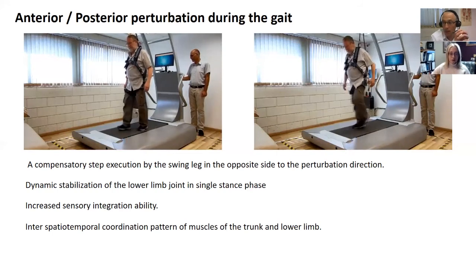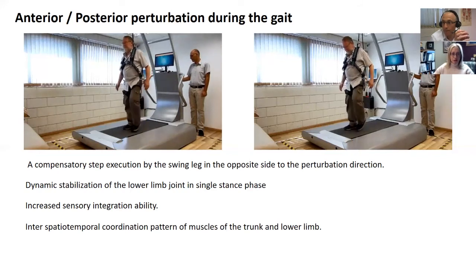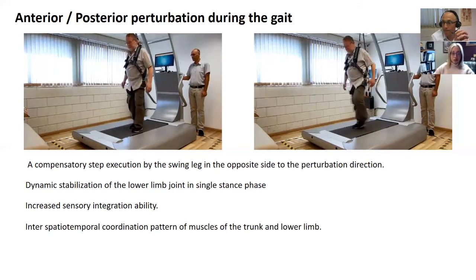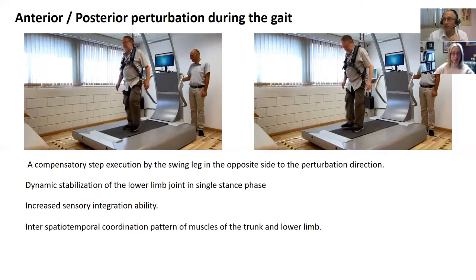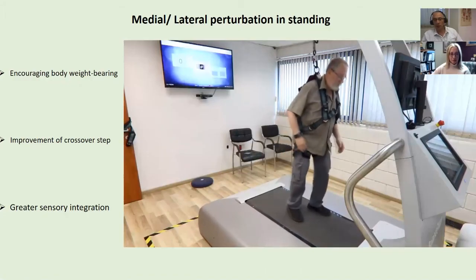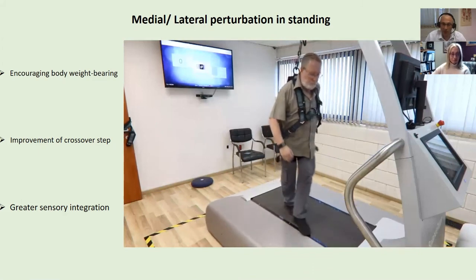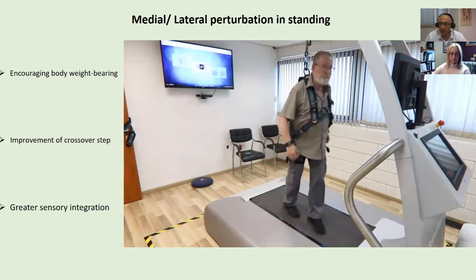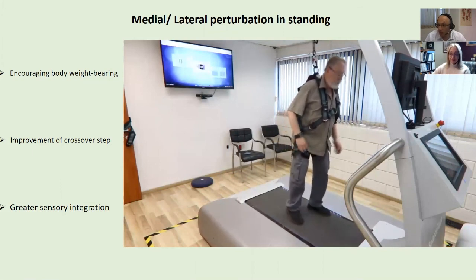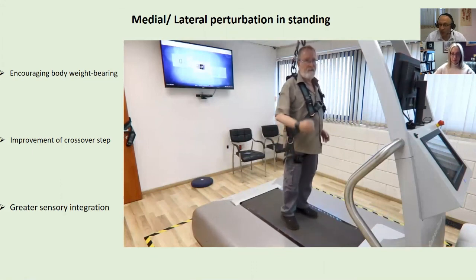Okay. Correct. Then there's also a program on the BalanceTutor that allows you to give a perturbation when you're on a stance leg. So you can flip right or left. That's right. For a little bit, and that's also excellent training. So in conclusion, we're encouraging different body weight strategies. Okay, we can improve crossover steps. We can work on step initiation as well, obviously, and we're all the time working on sensory integration. So I think that's a good conclusion.